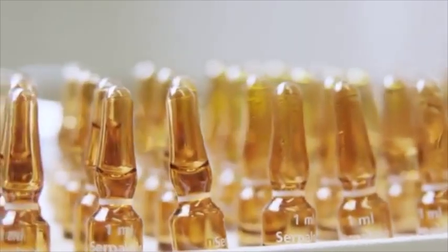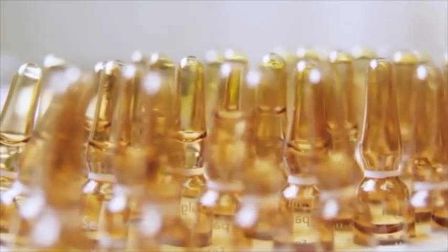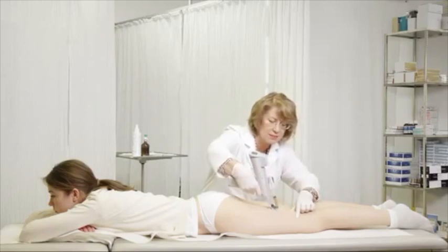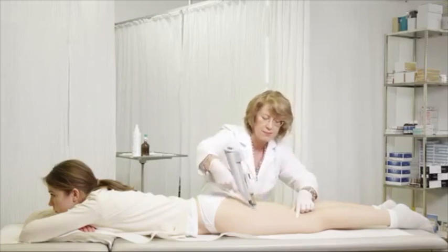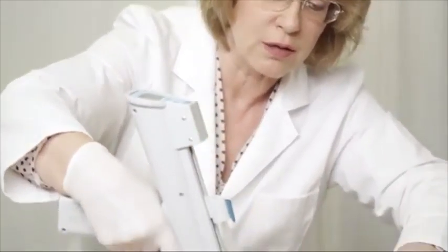Mesotherapy can be used for a multitude of diseases and in the field of medical anti-aging and aesthetics. For example, in the treatment of cellulite. Here, the doctor works with electronic injectors. This guarantees a standard application in quantity and injection mode. The drops can often be seen lying on the surface. This application mode is correct because the skin will absorb them like a sponge. It provides a long-term efficiency.